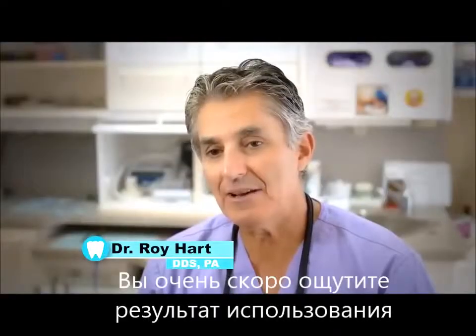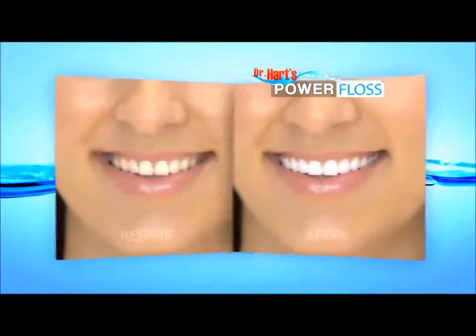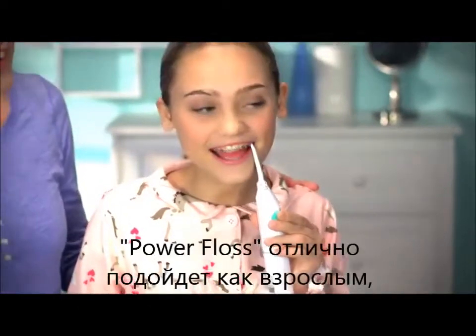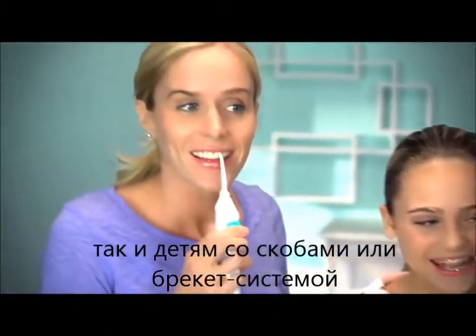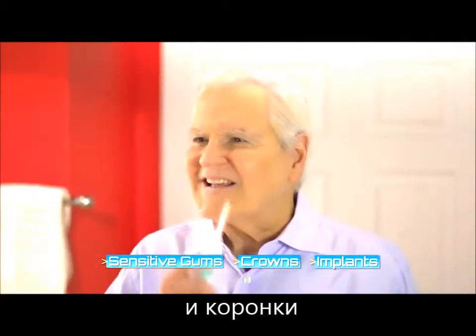Power Floss patients are definitely seeing results. The irrigation is happening. Long-term results are healthy gums, healthy teeth, and a healthy mouth. Power Floss is great for kids and adults with braces. It's ideal for people with sensitive gums, crowns, implants, and dental work.